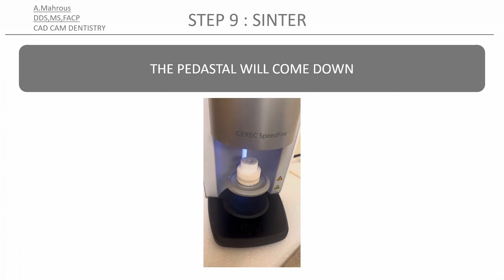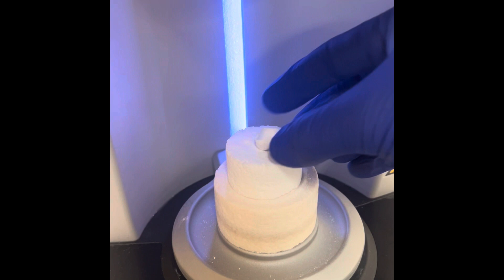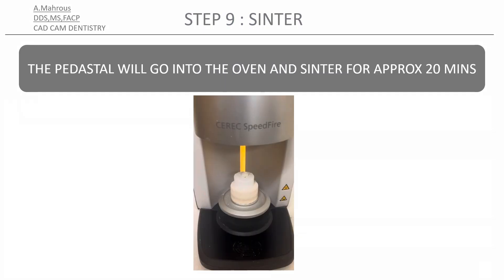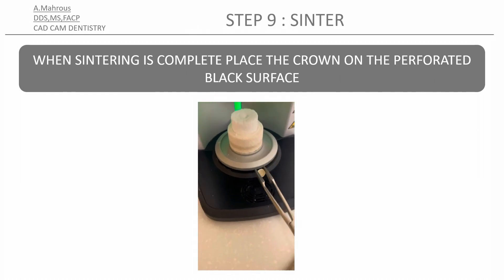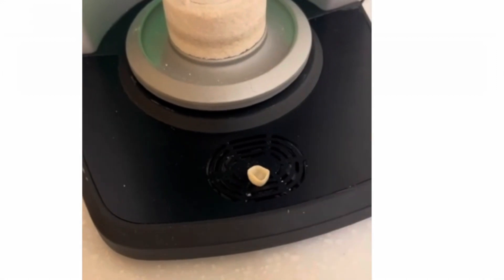You'll find that the pedestal comes down out of the speed fire. Go ahead and place the crown with the margins pointing upwards and the occlusal surface down. Press the play button and you'll see the pedestal rising once again into the speed fire. After about 20 minutes the crown is ready and very hot, so use the tongs and place the crown on the black perforated area of the speed fire.